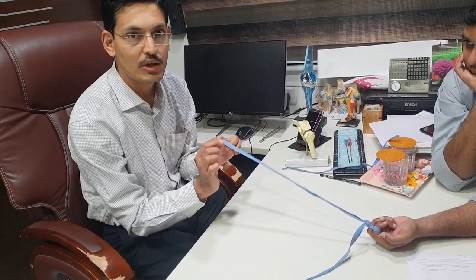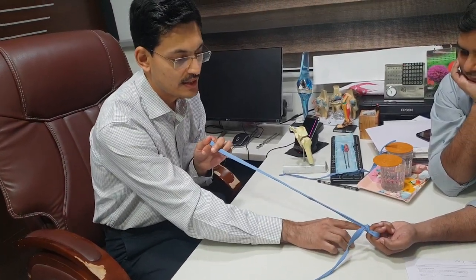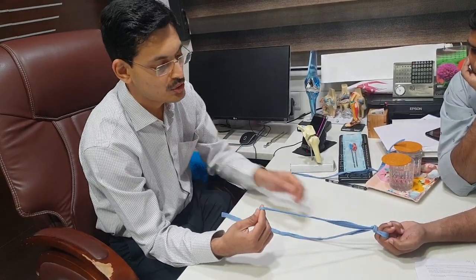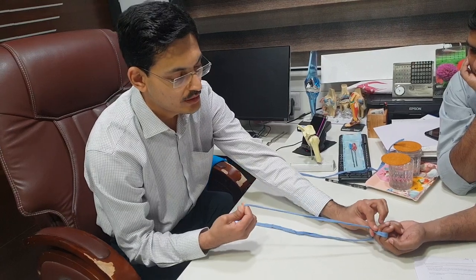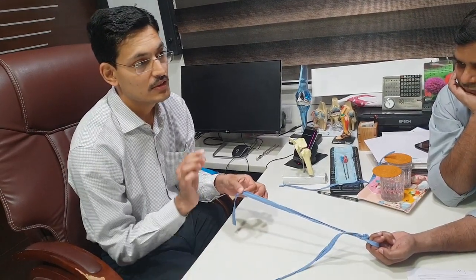When you are pushing the knot in, you'll use your knot pusher to press it right there. When you pull the other one, the knot will get locked. You keep it like this, and when you pull it the knot will get locked. Once you pull the other strand, further sliding will not be possible.